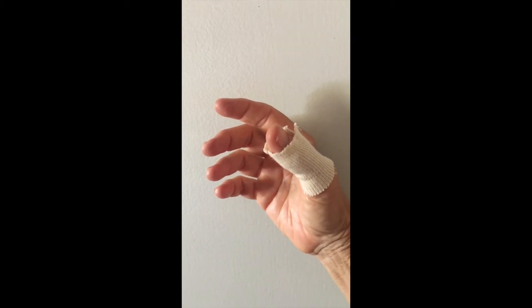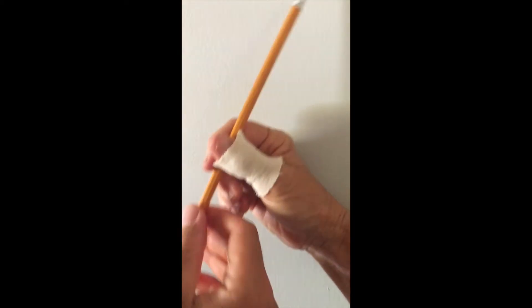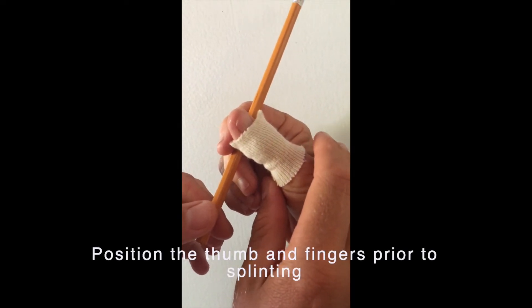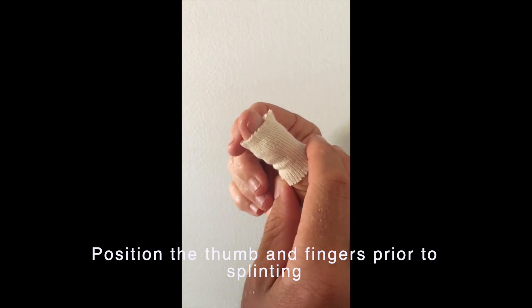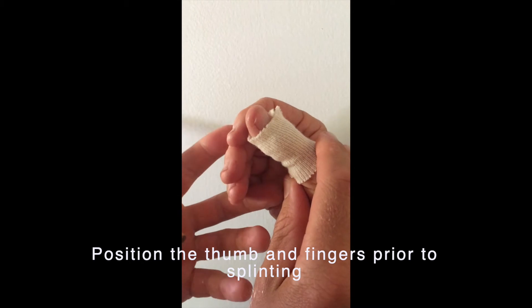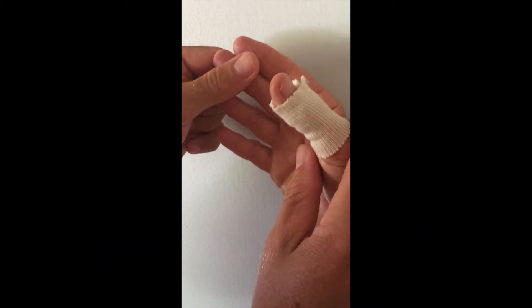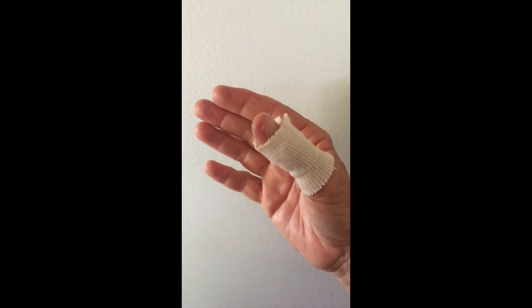Just act like you're going to write with that pencil — that's the position we want the thumb to be in, right here. If you could just keep your thumb right in that position, take the pencil out, and try to bring up your fingers while keeping your thumb right there. That's the position we want to splint in — just a functional position like that.